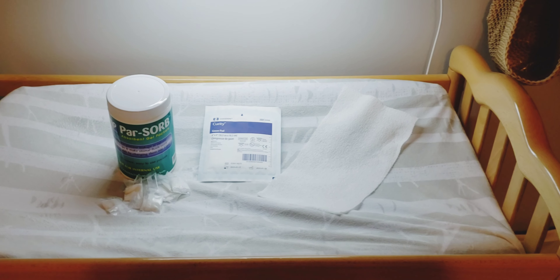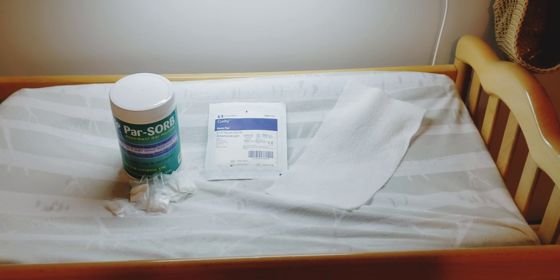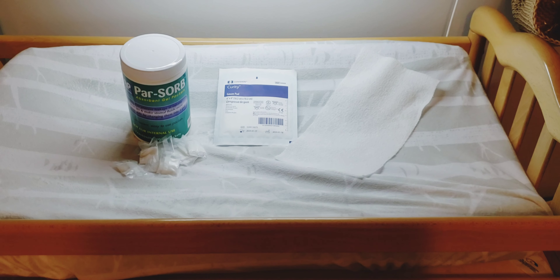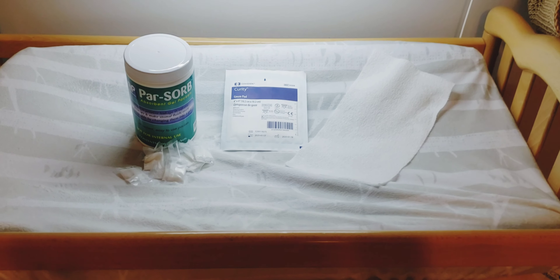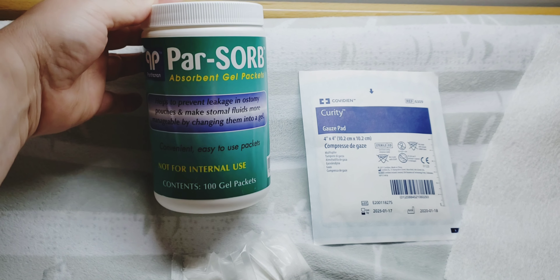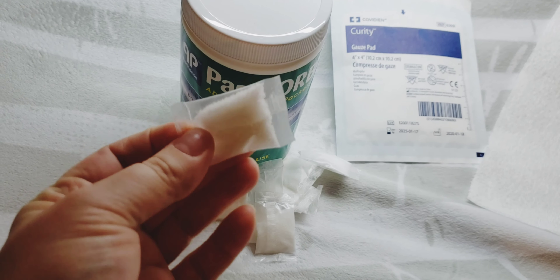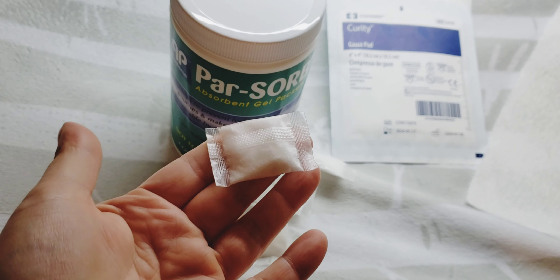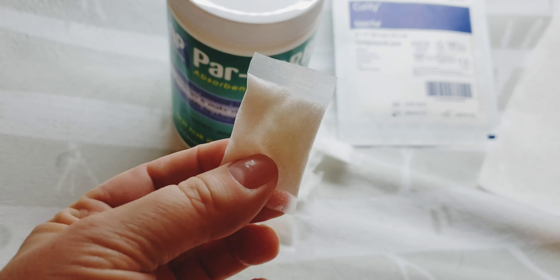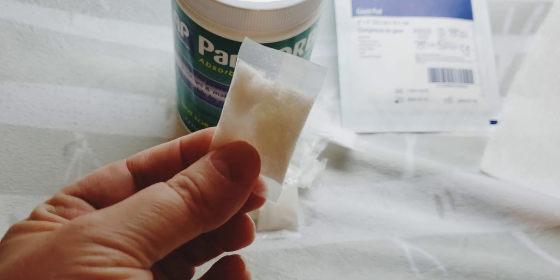Hey everybody, welcome back. I have some good ideas for what to do when your baby's output is very liquidy, especially during that clean out. My absolute favorite to put inside the bag is Parsorb. They're these little bags and you drop them in whole, and then the bag disintegrates or opens up and these little tiny beads are in it. It reminds me of what's inside of a disposable diaper.